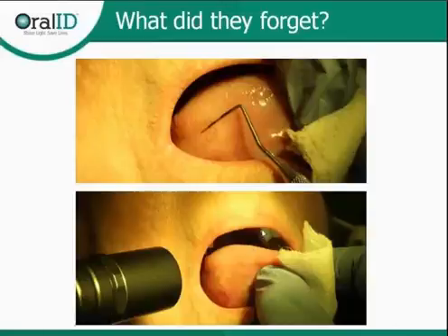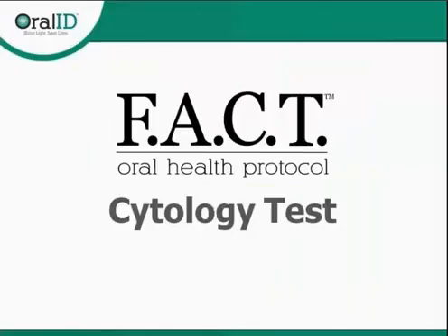So I know they turned the device on because you can see that the teeth are kind of green as it gets darker in the back of the mouth. I also know that they have the smart filter over the lens because then nothing would look green, it would look blue. I can see in the background the lighting's turned down. So what I think happened is they forgot to turn the flash off. And so that's why there's that increase in white light. So one little simple step could make all the difference. And so as you're taking pictures, just go through this troubleshooting to help correct.